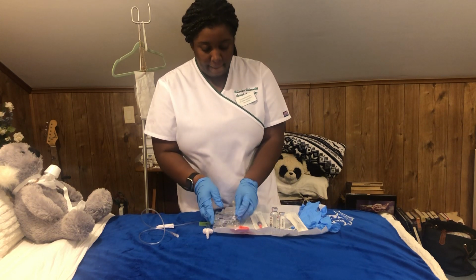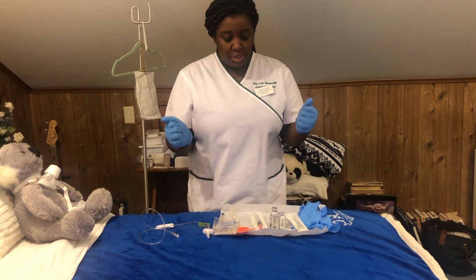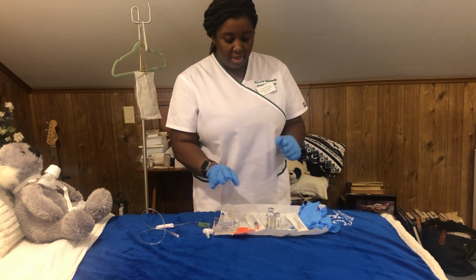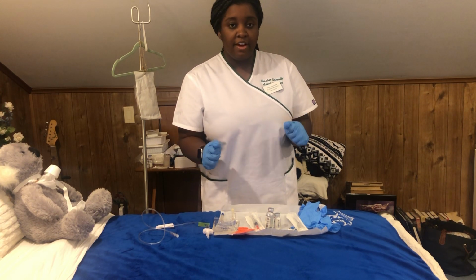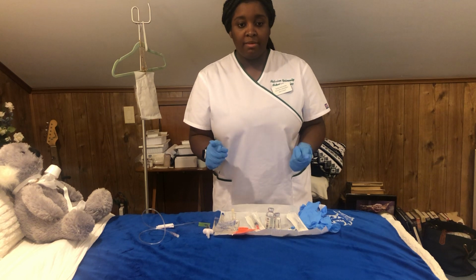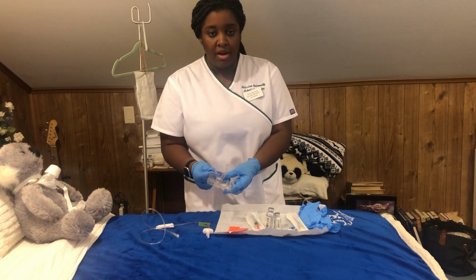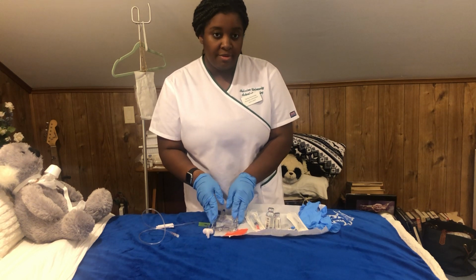sodium chloride pouch. Okay. So before I continue, I'll just do a quick medication calculation to know exactly how much normal saline I will be putting into my vancomycin for reconstitution. According to the order and on the bottle and from my calculation, I will be inserting 5.6 ml of normal saline into the vancomycin for a total of 6 ml into the container, and then after that I will use another syringe to withdraw 1 ml of the medication and insert that into the pouch, which will then become my piggyback pouch, where I'll bring to the patient room to administer the medication.